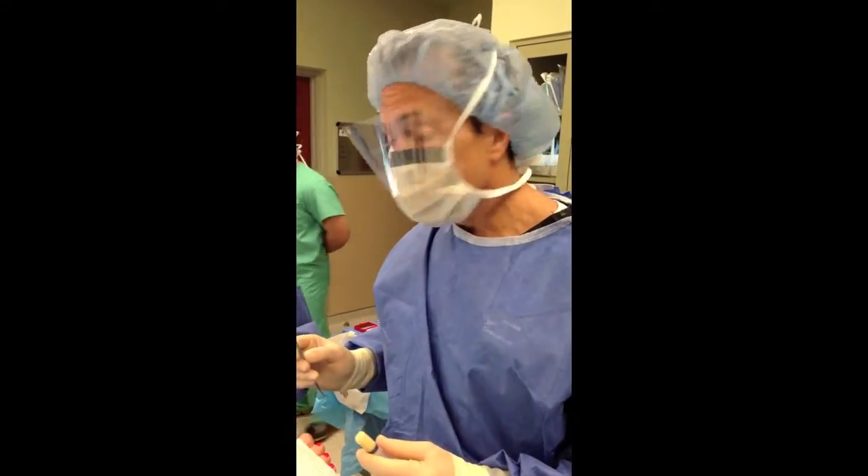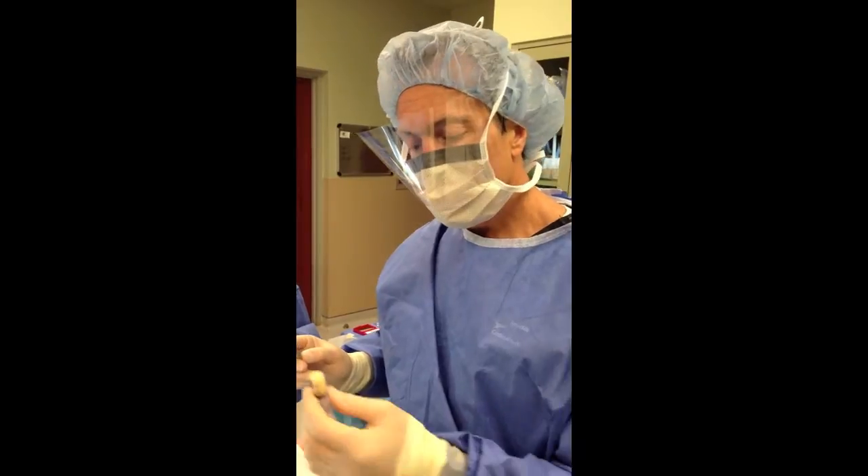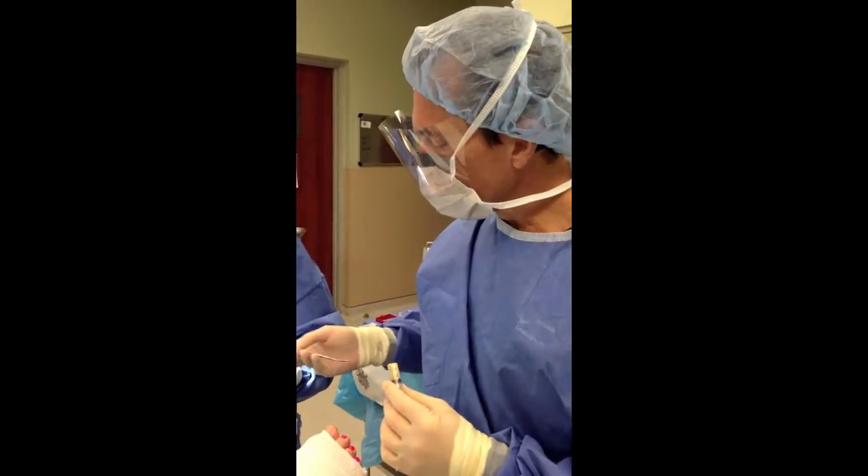Hi, I'm Dr. Moore of Moore Foot and Ankle Specialists. We're going to use the Solano 10-6 Bone Putty Crush Mix to fill this void.